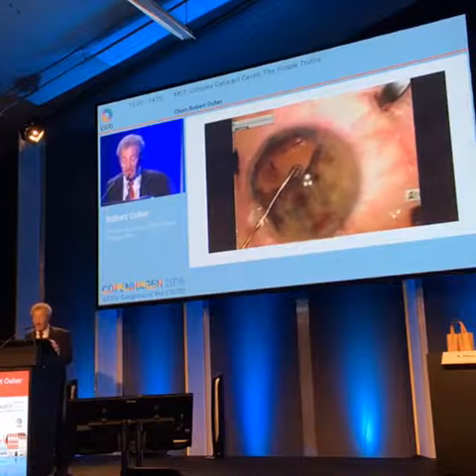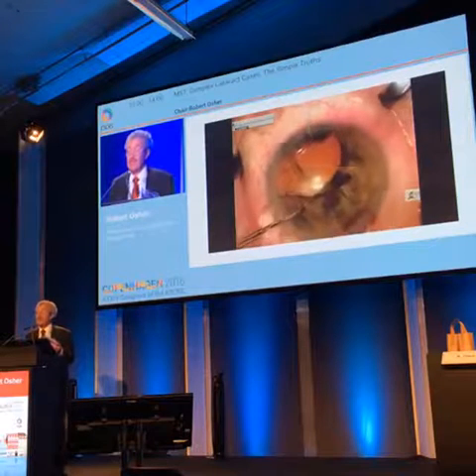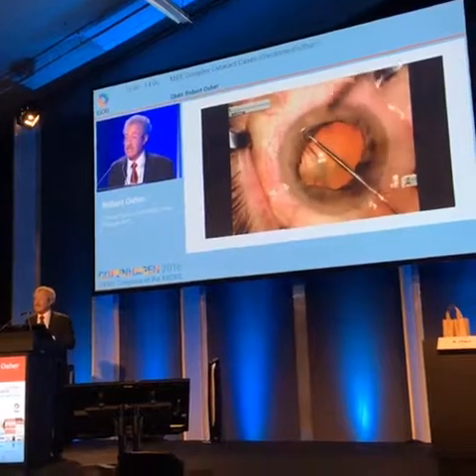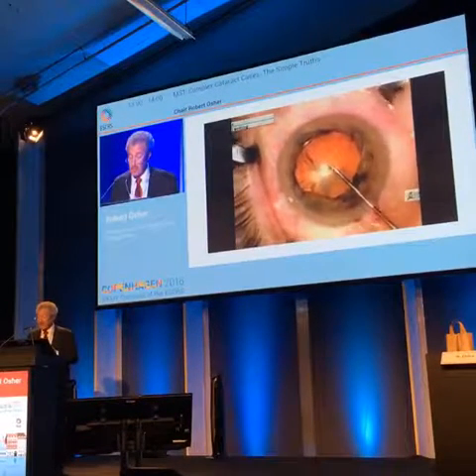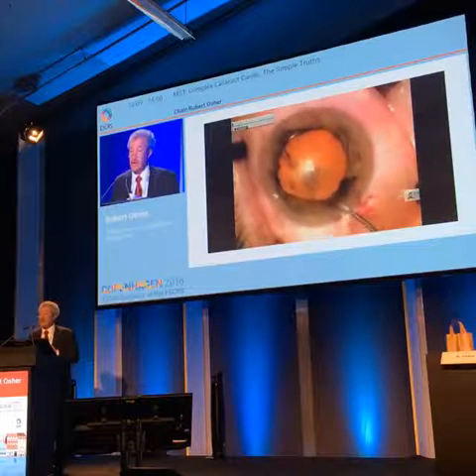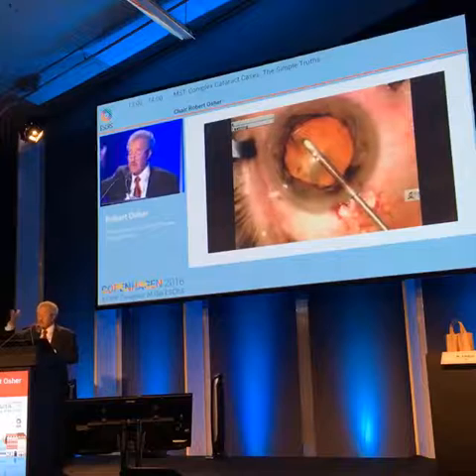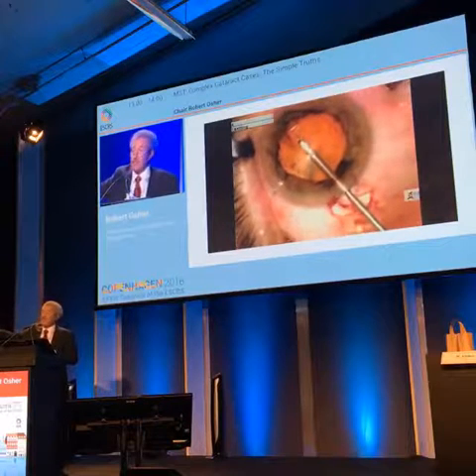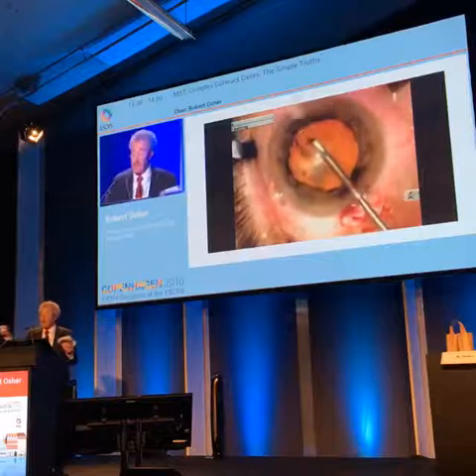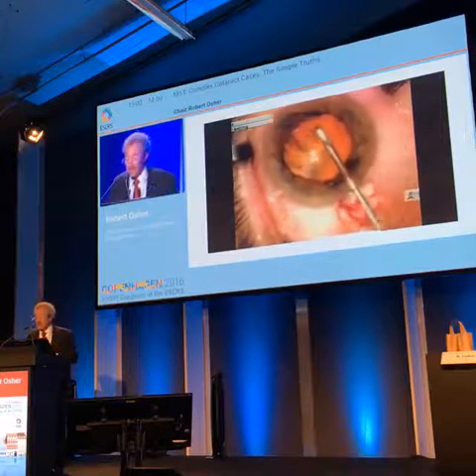David Chang published some time ago how you go through the pars plana to remove some vitreous. I've never had to do that. Every retinal specialist will tell you that. So if you give mannitol 20 minutes before, and you press on the eye with a muscle hook against the bony orbit for 5 minutes, the eye is mushy soft, and then when I put in Healon 5, I have a nice anterior chamber to work in.